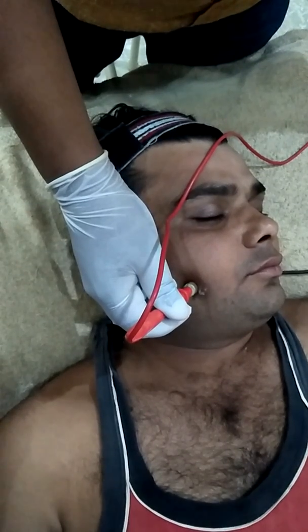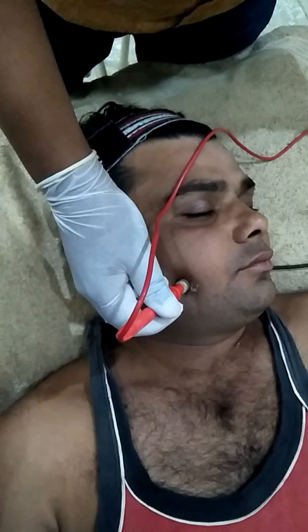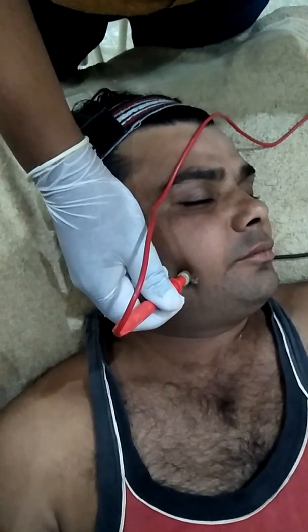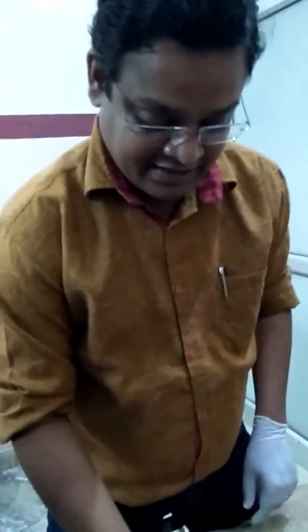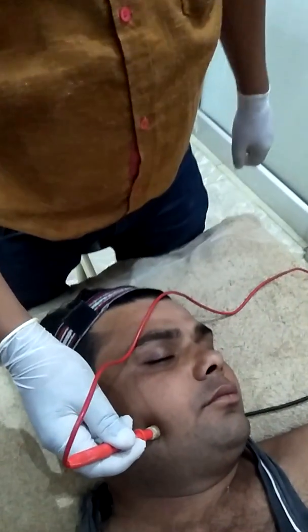When you increase the intensity, you see the contraction, just like a smile, because in facial palsy the main thing is that the patient loses his smile. See the contraction.